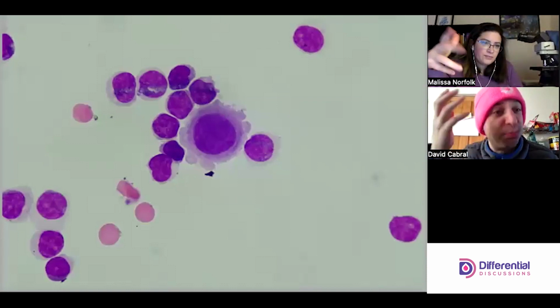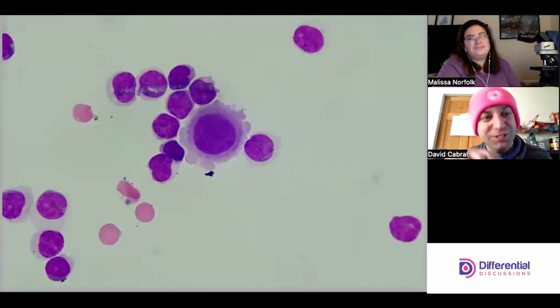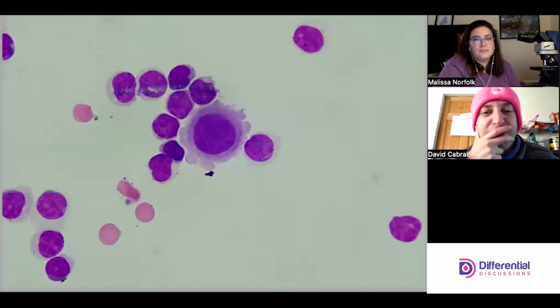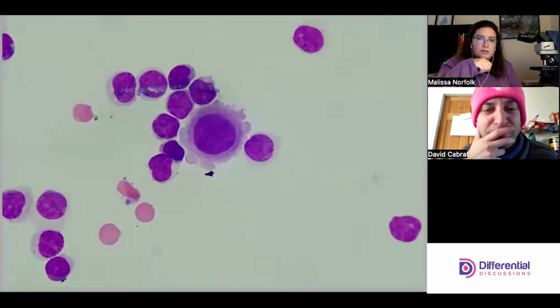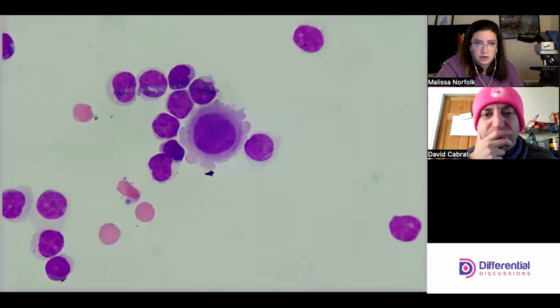Yes. Nice, beautiful, normal NC ratio, round. Yeah. I mean, technically this cell is way too big, it's really the size of the nucleus, because the staining pattern looks appropriate. You don't have those deep dark areas. The stain looks okay in both the cytoplasm and the nucleus. So it's really mostly the NC ratio here. Yep. I agree.